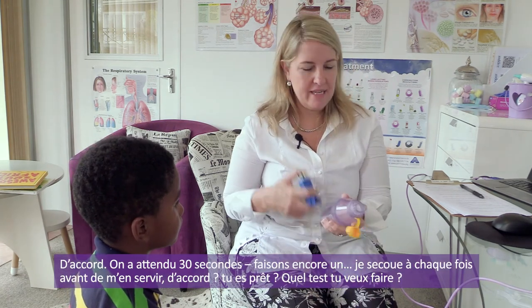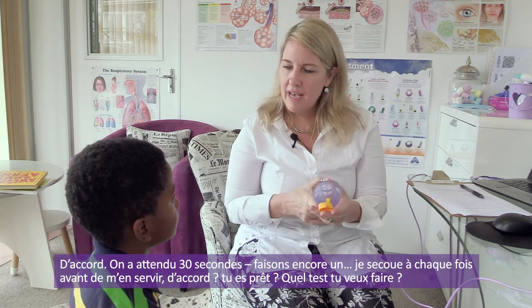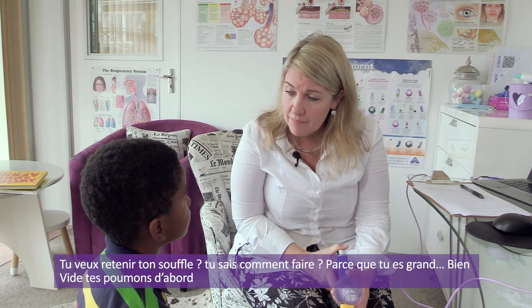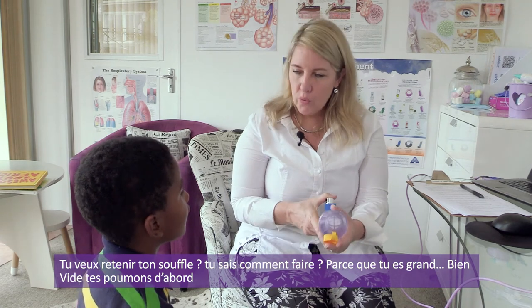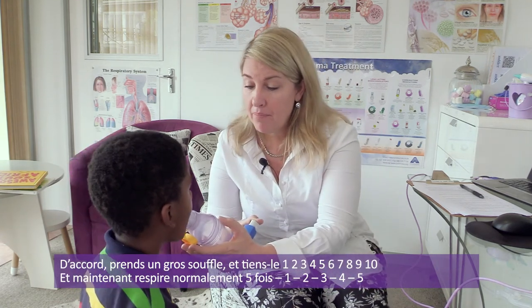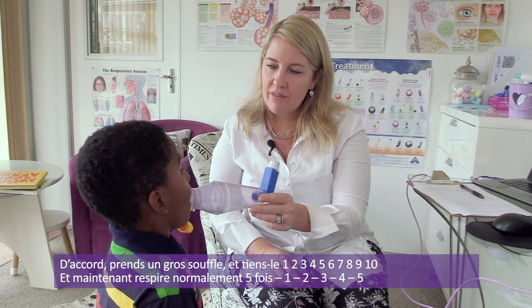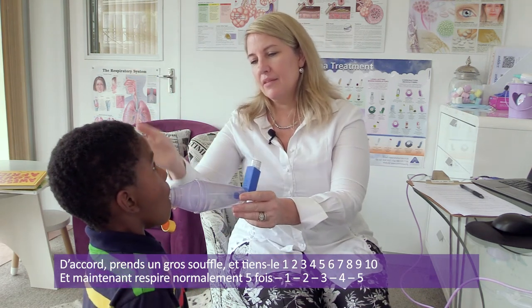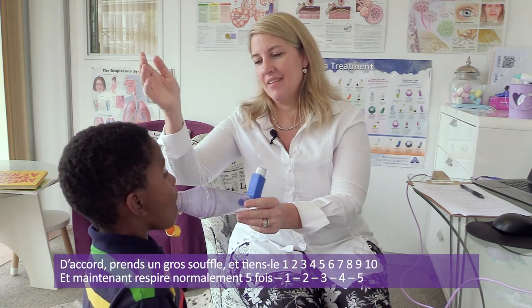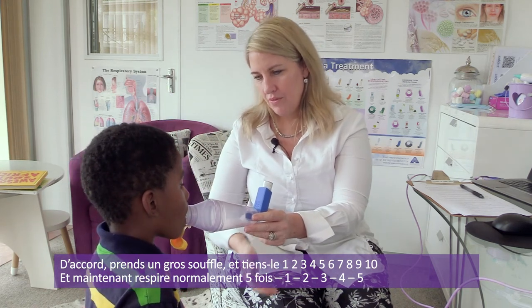All right. So we've waited 30 seconds. Okay. Let's do another one. Remember, I shake it every time before I use it. Okay. Are you ready? Which one do you want to do? Do you want to hold your breath? You know how to do it because you're big. Good. Okay. Breathe out. Okay. Now, big one. Big breath. Go. Hold, 2, 3, 4, 5, 6, 7, 8, 9, 10. Big breaths in and out. 1, 2. Good. 3, 4. Good. Okay, just rest.